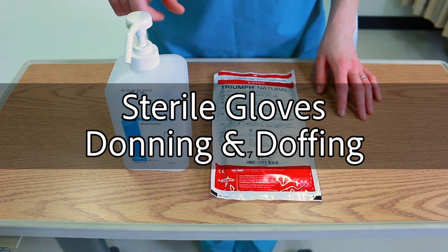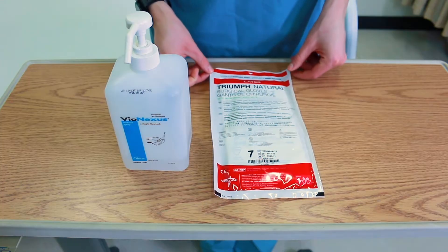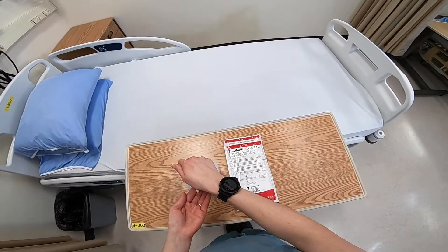For applying sterile gloves, you will need hand sanitizer and sterile gloves in your size. First, perform hand hygiene.